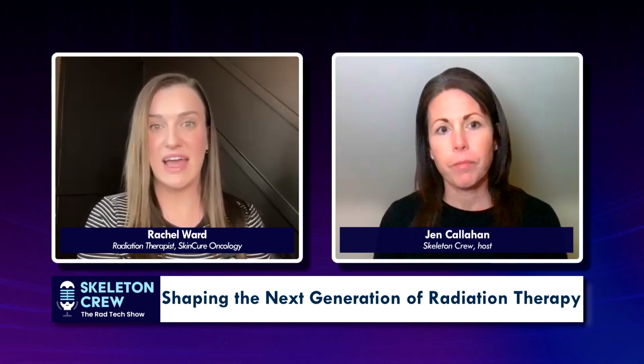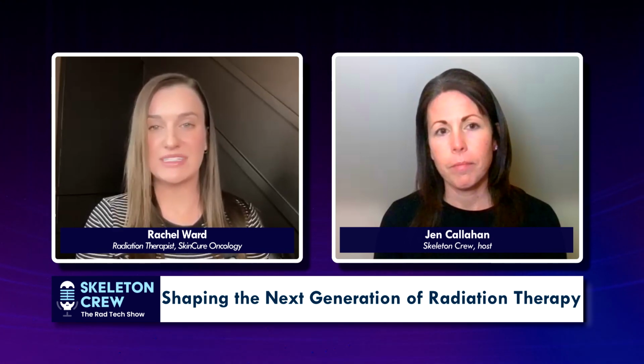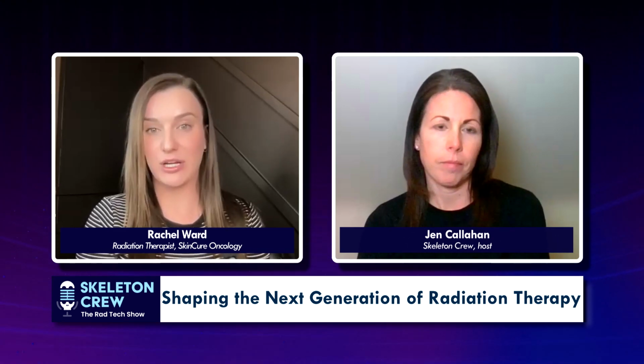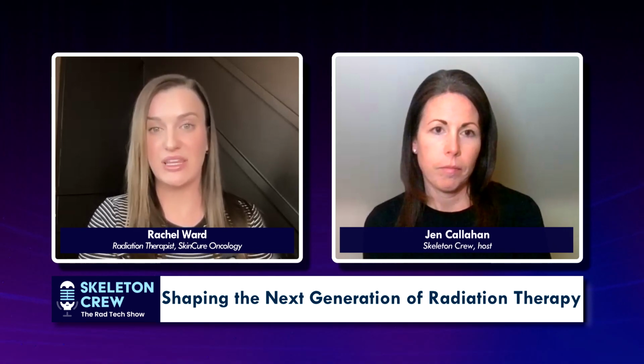So you're trained as, like myself, you have your RT, but then you went even further and became a rad therapist. And then do you do the actual ultrasound or does a doctor do it with you? We're radiation therapists and we are using that ultrasound as our onboard imaging. So just like we can take portal images or our CBCT to do alignments for our treatments, this is our onboard imaging. So we, as radiation therapists, are the ones doing the ultrasound for this. And actually, I don't have a diagnostic background as an RT. Okay. I went right into radiation therapy.